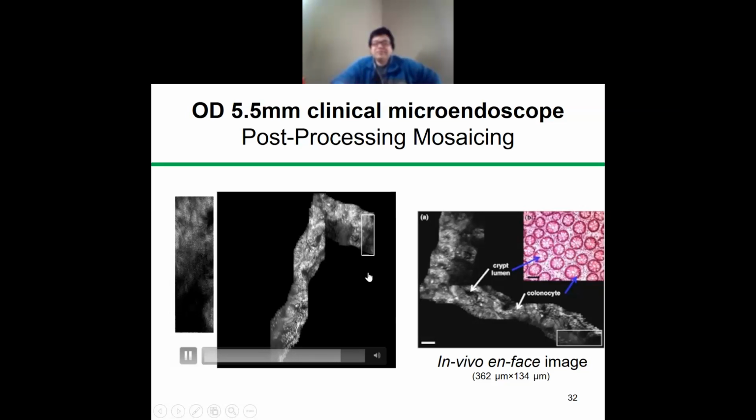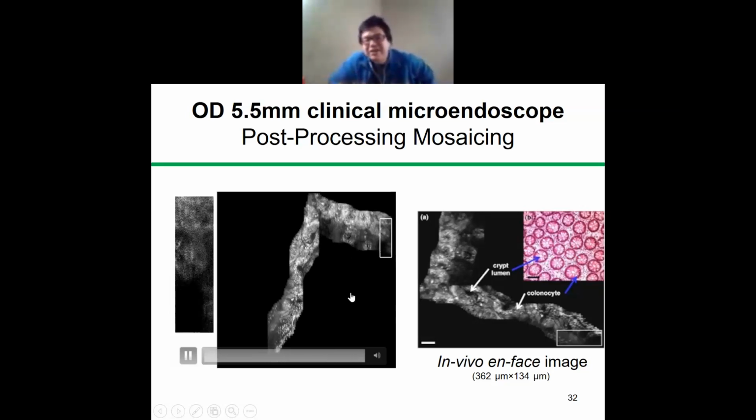That's why algorithms and data processing are so essential. Then you get a very good image, and you can even enhance the resolution. Recently we published a paper in OSA Biomedical Optics Express. We can enhance the signal and also the resolution a little bit using deep learning. Also, in computer vision, people know that even with a low resolution camera, if you stay at one area and keep scanning, the signal to noise ratio can be essentially improved.